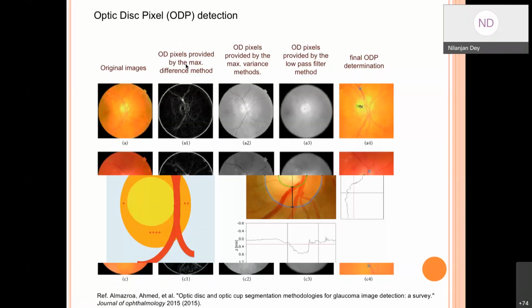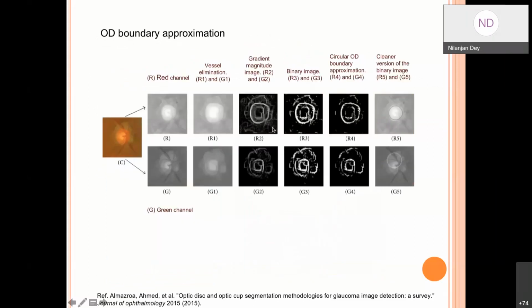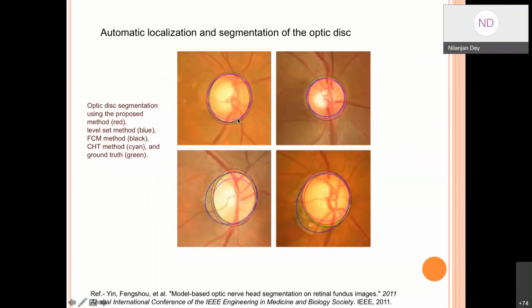So you can find out the cup and disc both by segmentation. And this is the NP here, true positive, false negative, etc. From there you can find out some F measures by which you can say how good your optical cup to disc detection is, and in this way you can find out the chances of glaucoma also.